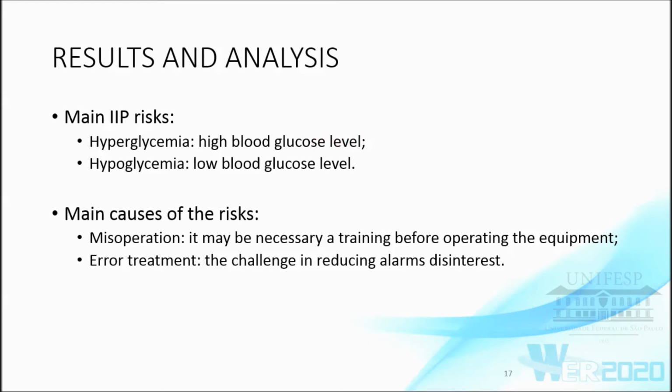And some of the popular causes of those errors are misoperation, that is caused by the person controlling the equipment. On the insulin infusion pump, the user himself. Then it is very important training or presentation of the equipment. And error treatment. That is, the equipment must emit alarms when adverse event happens. But if too many alerts are generated, may occur alarm fatigue, that is the disinterest in take action for the warnings. So the challenge in reducing alarm disinterest is multifaceted.